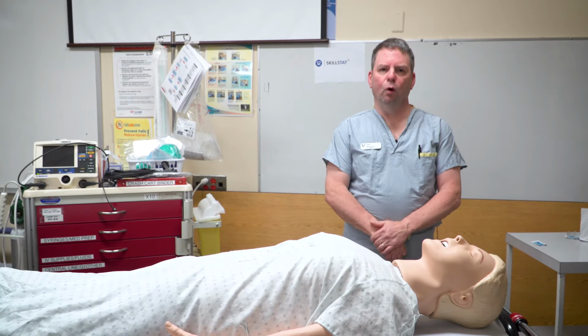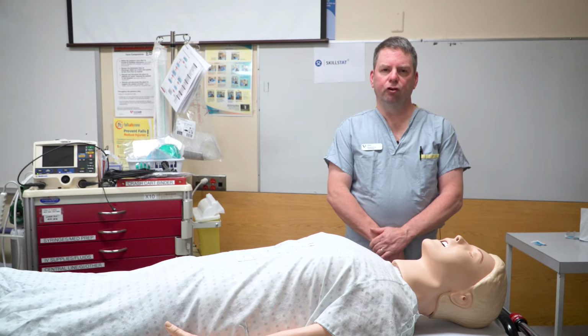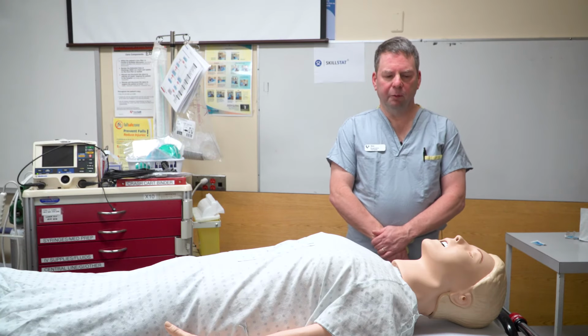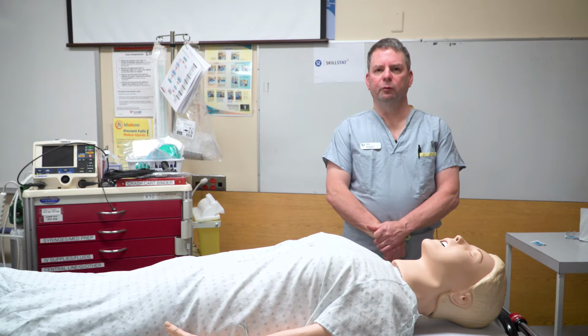Ideally, you would use the oropharyngeal airway, particularly if you're trying to bag somebody, but in cases where the patient has a gag reflex, you won't be able to use the oropharyngeal airway. So at that point, you may choose the nasopharyngeal airway. There are some benefits to using it, but there are also some risks.